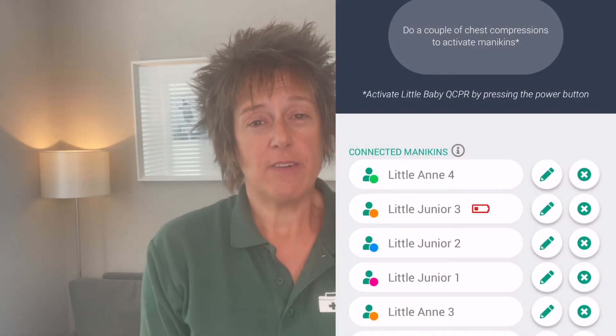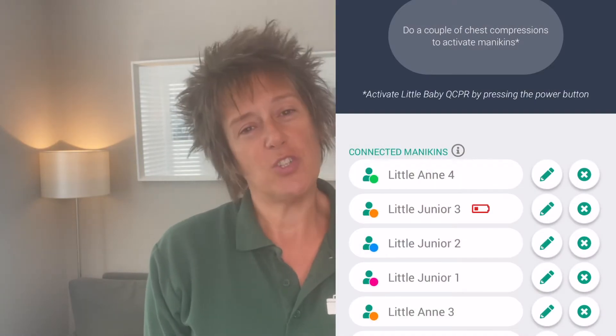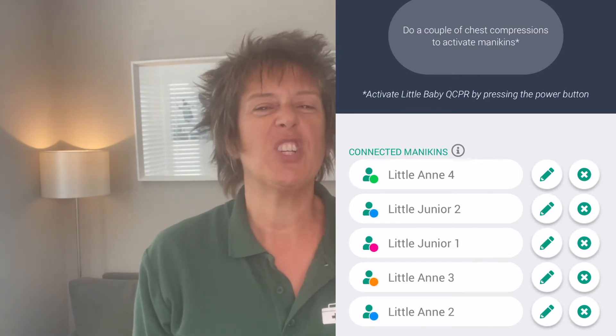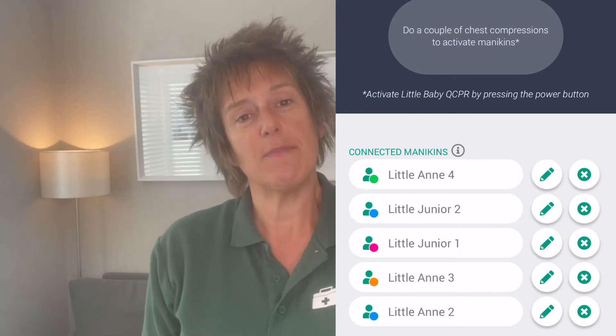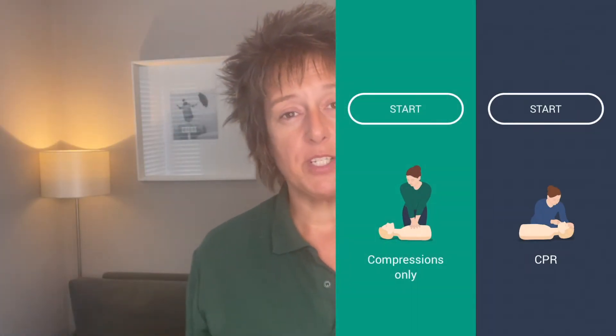You can see I've got it connected to my phone here. I just select which mannequins I want to use — the phone can hold up to six mannequins at a time, but with an iPad I can have more connected depending on the screen size. I'll choose whether it's the adults, juniors, or babies, and make sure I tell learners what their number is so I can say 'learner one, push down a bit deeper' or 'learner two, you need to release a bit more.'